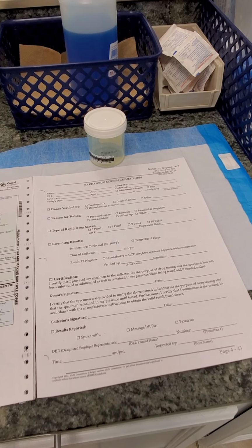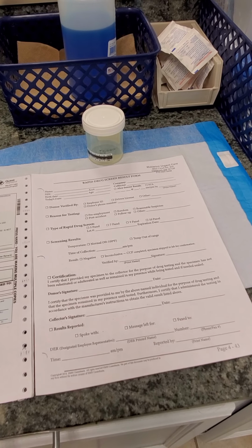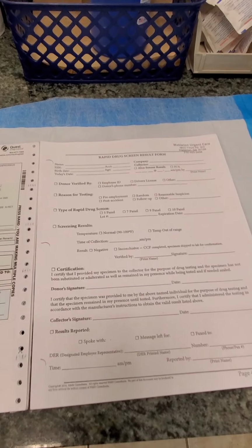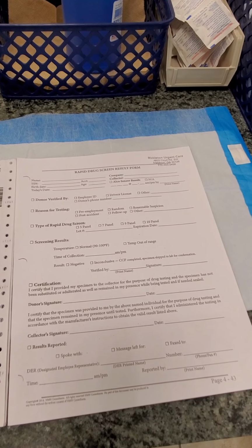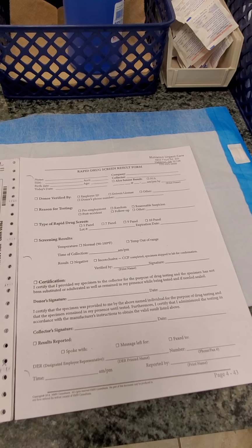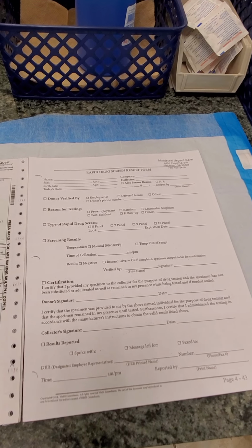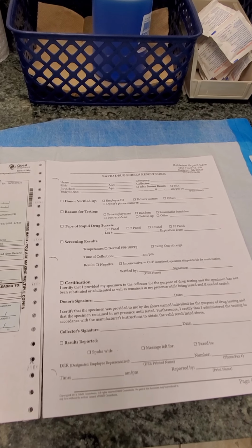So do not say that, because if you say it tested positive for marijuana and then it comes back that it was negative, then you might be in a little trouble, legally trouble or whatnot. So don't ever say what it went out for. And yes, I hope this helps. This video helps understand how to properly do a drug test.